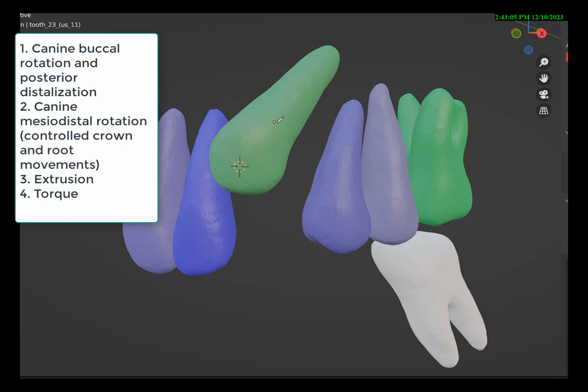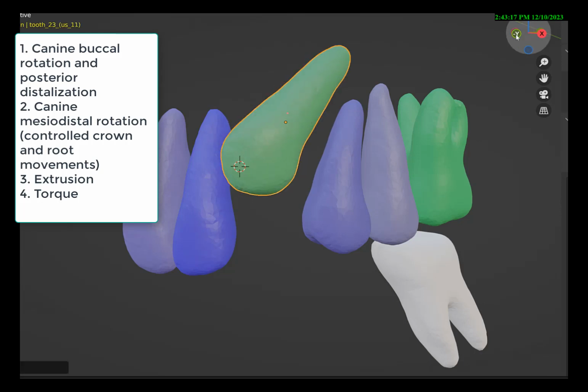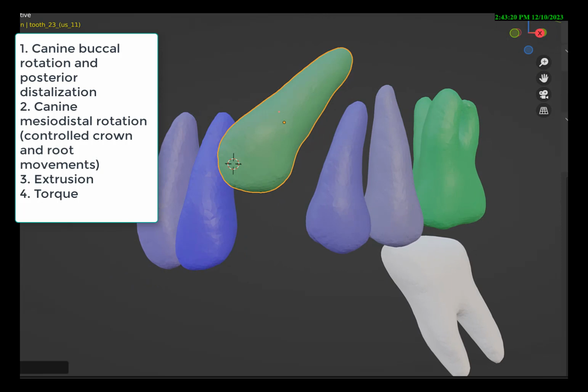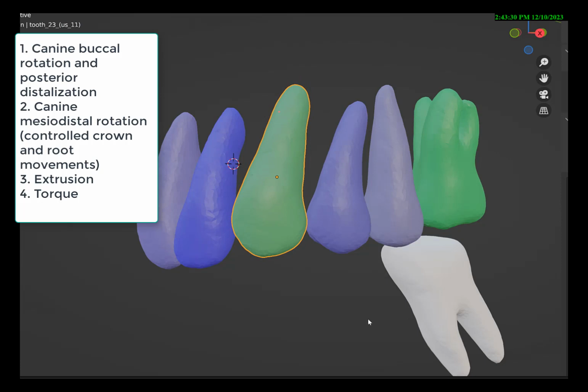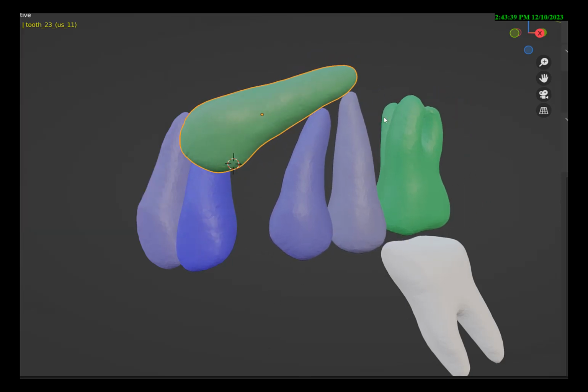Again, this tooth should probably be pushed a little bit more to the side. Let's do it right now. A little bit more, so it stays away from the lateral incisor. And you bring the tooth down and then you torque. You could argue that you can also torque the tooth at the same time if you can. So you can see that there are many more movements to be calculated and complex appliances to be made than just using a straight wire and putting on a coil spring, because then you get torque issues, tipping issues, and probably root resorption issues.